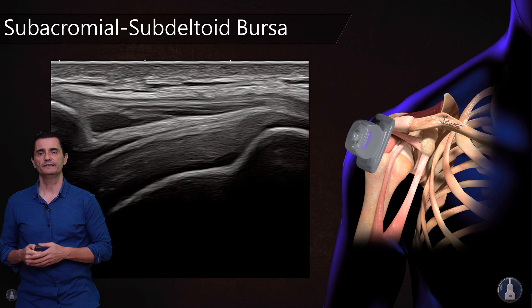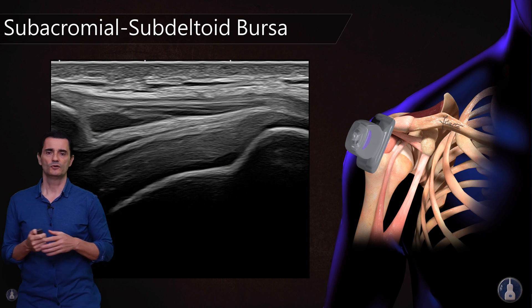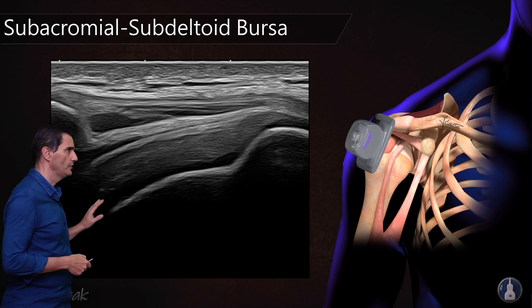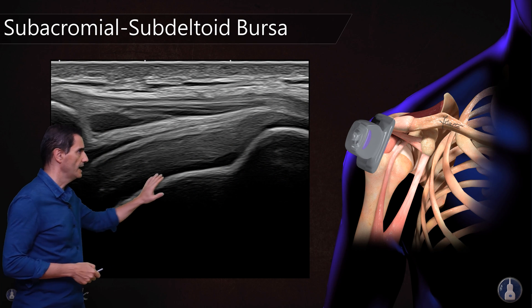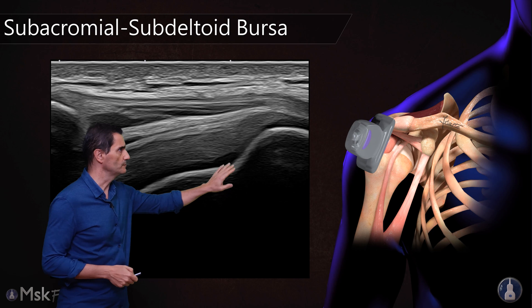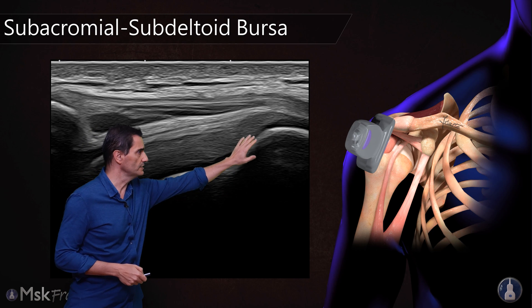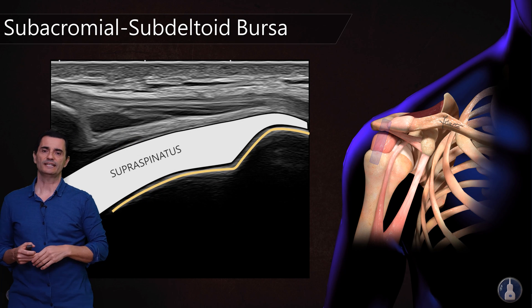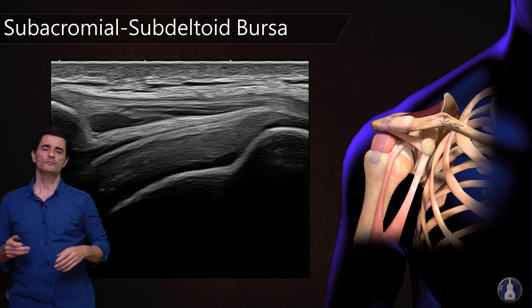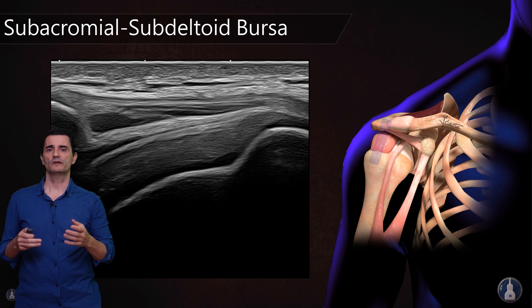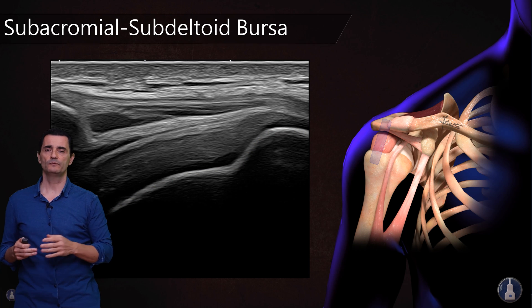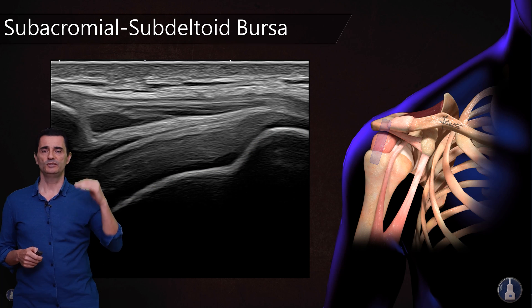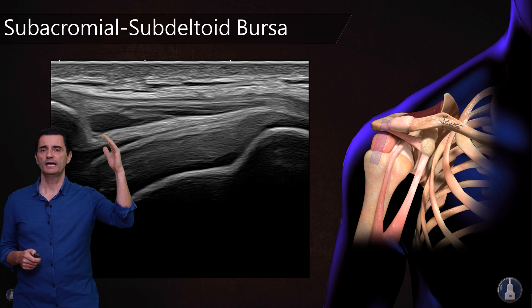We will obtain this image with the humeral head and the supraspinatus footprint, so this will be the supraspinatus tendon.